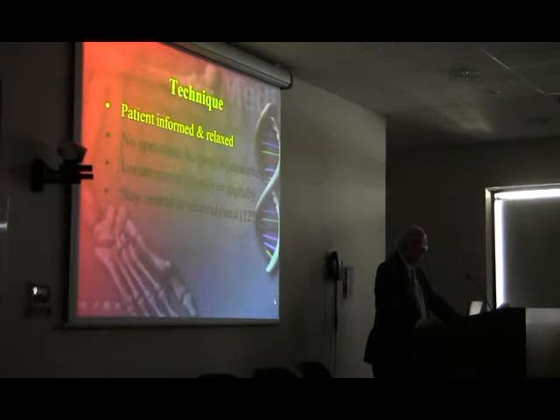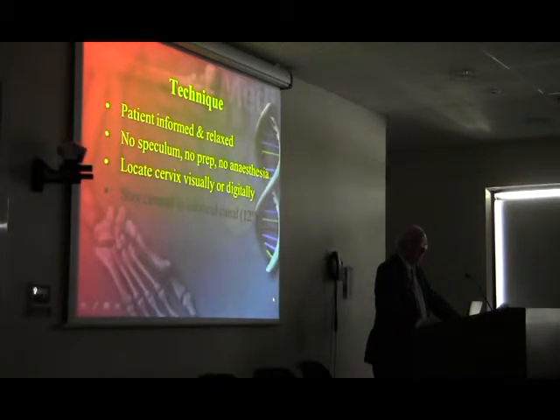So patient informed and relaxed, no speculum, no prep, visually or digitally. And I think Walter is saying that maybe there are two techniques. I think maybe it's probably easier to look on them as one technique, where you would introduce the hysteroscope through the vagina without anything. And if you see the cervix, in you go, good and well. If you don't, and in some places, people are different, the anatomy is different, sometimes you won't. So in those cases, I would often put in a finger at that stage to see where the cervix is and get it through. But it's not necessary in every case.